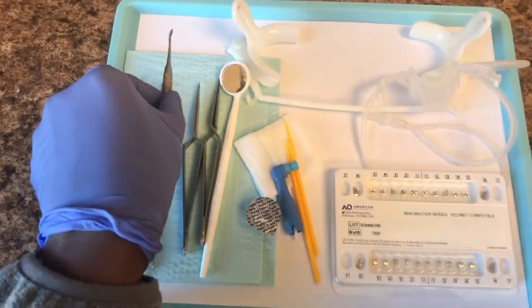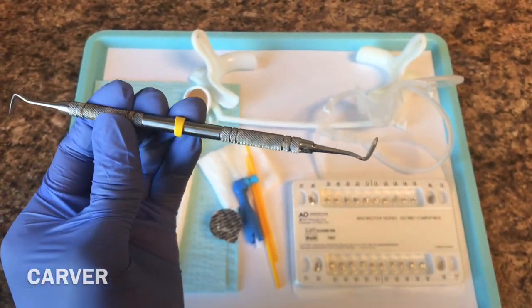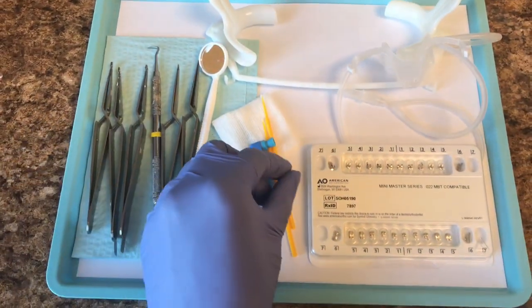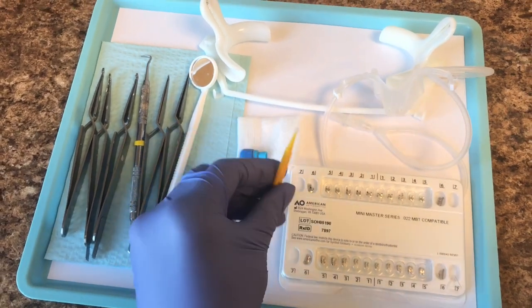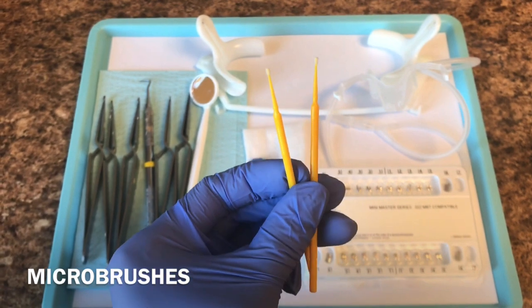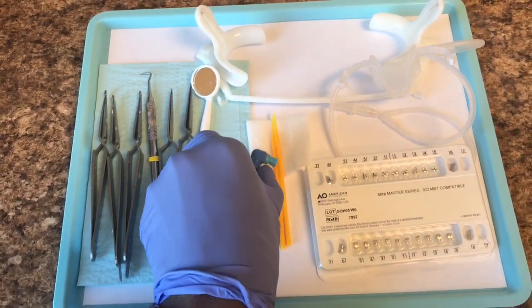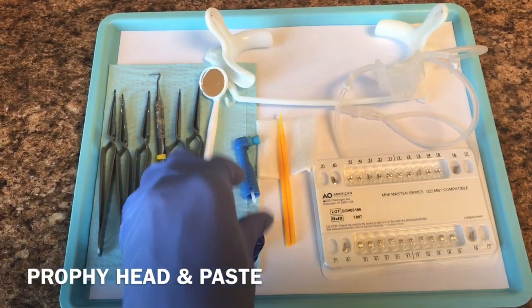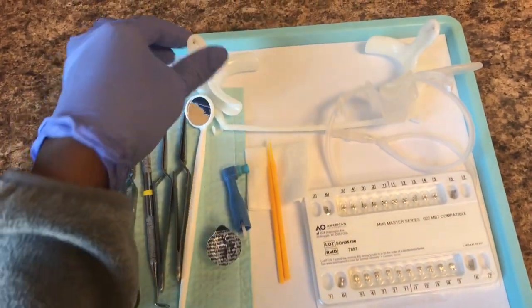We have a carver. The doctor will use this to align the bracket when it's on the tooth, because each bracket has to be aligned in a certain position. These are just micro brushes, which are used to apply the conditioner and the etch on the teeth before we get the brackets on. We have your profi head here, along with your profi paste, which is used to clean the patient's teeth before we get the brackets on as well.